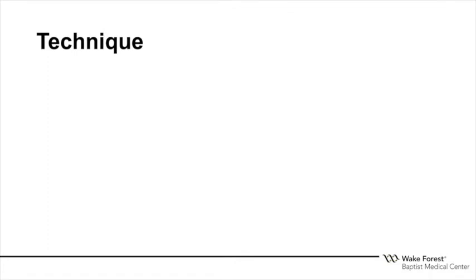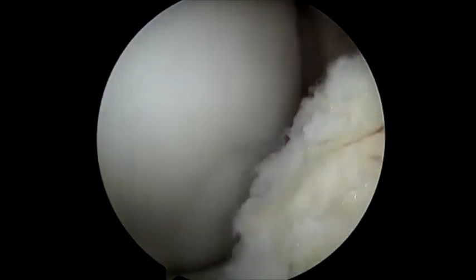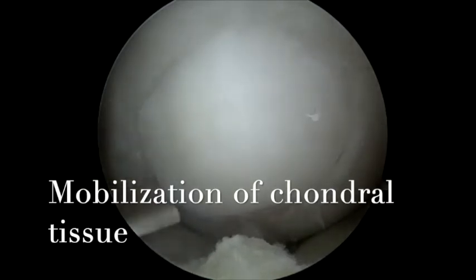After consultation, the decision was made to proceed with arthroscopic surgery. Following diagnostic arthroscopy, the medial femoral condyle lesion was evaluated while viewing from the standard lateral portal. This lesion demonstrated micro-instability with range of motion. While viewing from the medial portal, an arthroscopic freer elevator was used to mobilize the chondral tissue and assess the level of instability. This demonstrated that the mobile fragment was attached at the anterior edge, creating a trapdoor lesion.